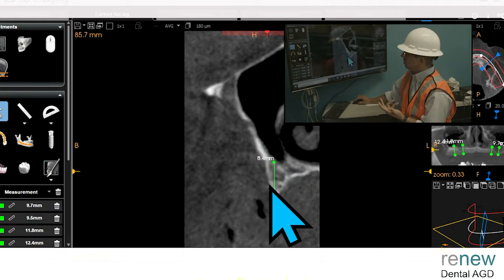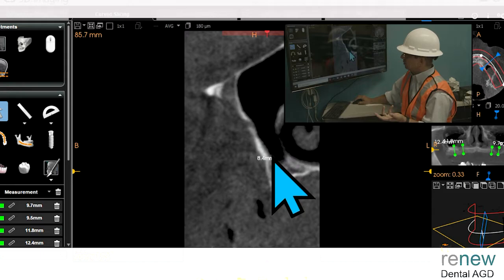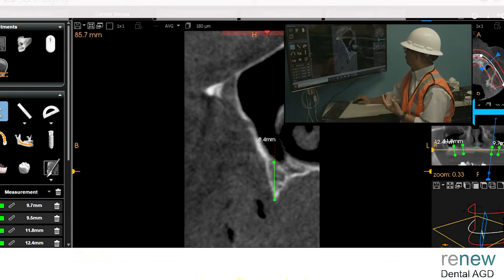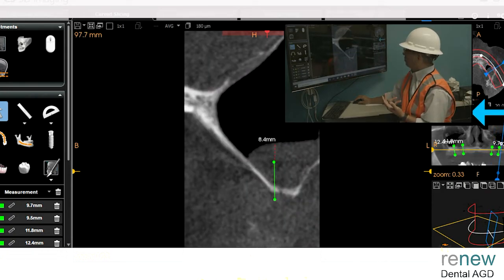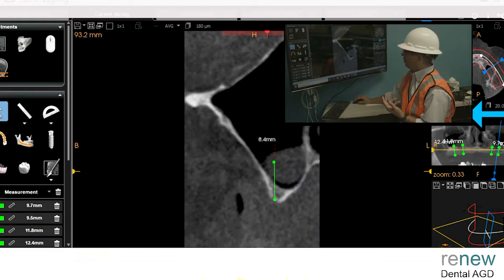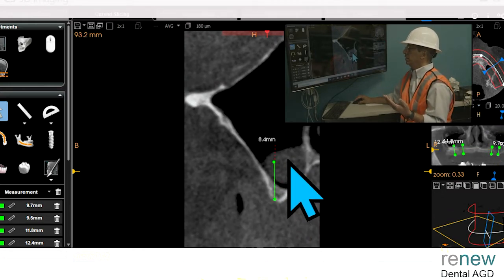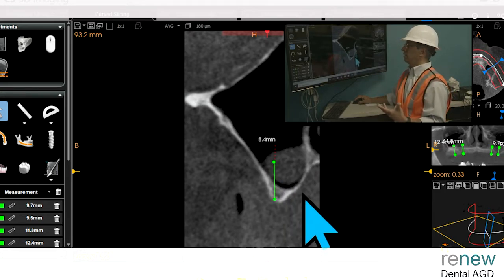You don't have a lot of room if you're trying to put an implant in. It's going to have to be a bit angled, probably something more in this direction. And then if you go back into the maxillary sinus, you have very, very thin bone once again, and you are looking to try to get that to heal.